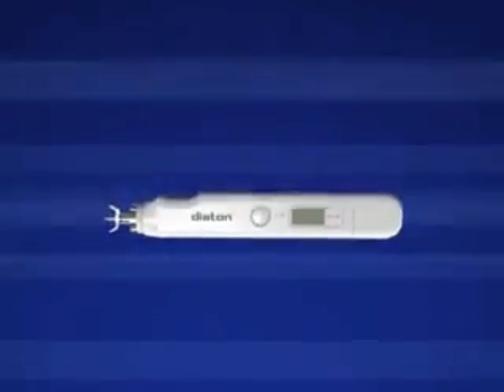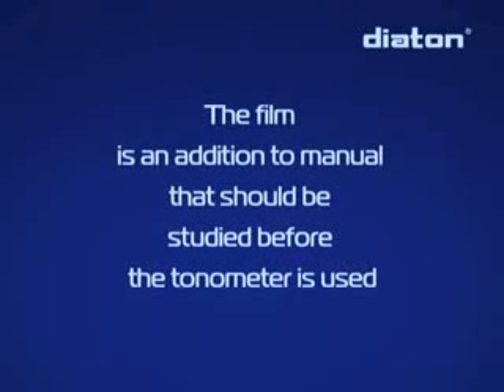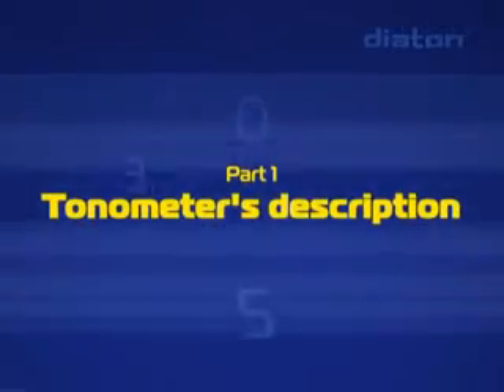The Diaton Tonometer measures intraocular pressure through the eyelid. The tonometer has an ergonomic plastic body.